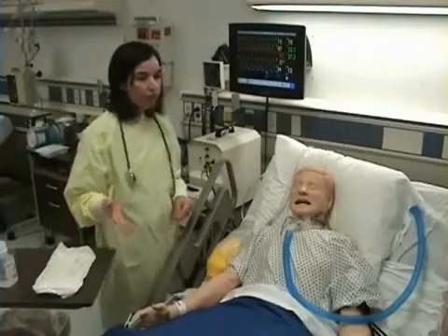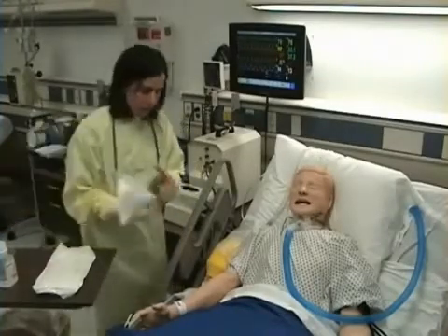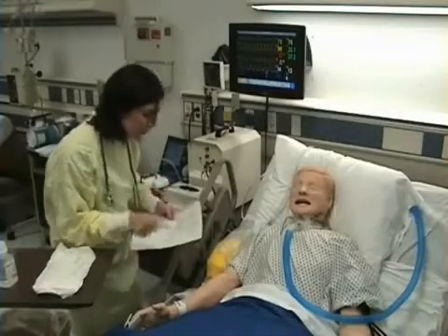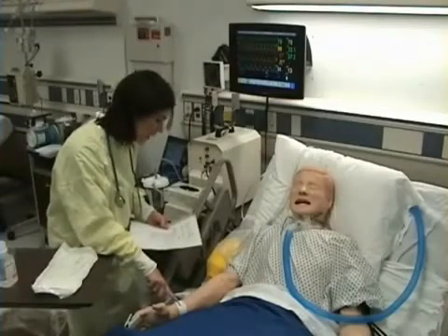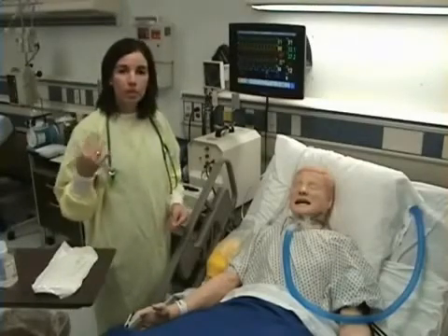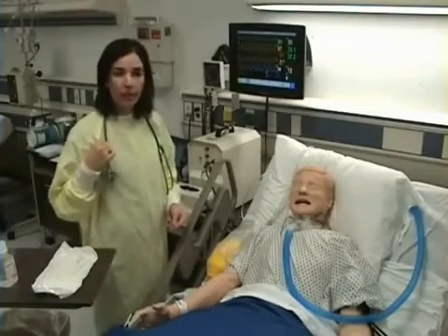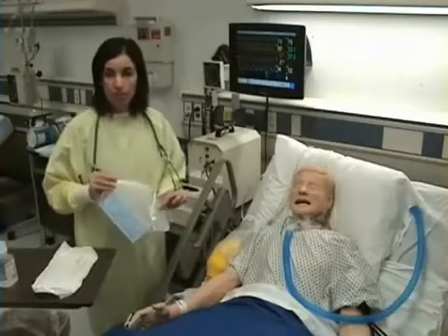I'm going to introduce myself, wash my hands. I want to have my patient's chart, and because he cannot speak with this trach, I'm going to check his identification bracelet, his name and his birthday and medical record number. Because I'm going to be dealing with secretions, I wear PPE, so I have a yellow gown on today to protect myself, and a mask with a face shield to protect my eyes.